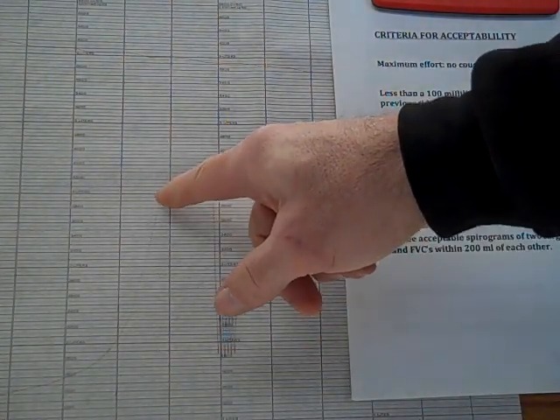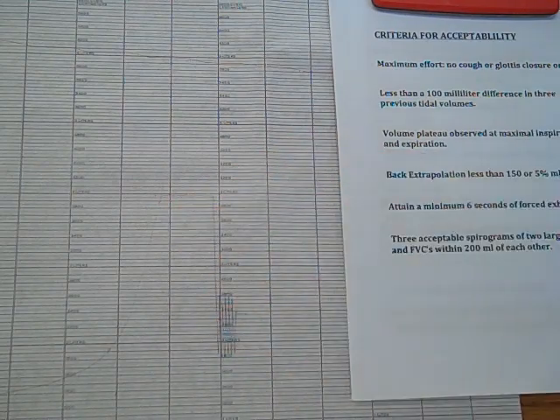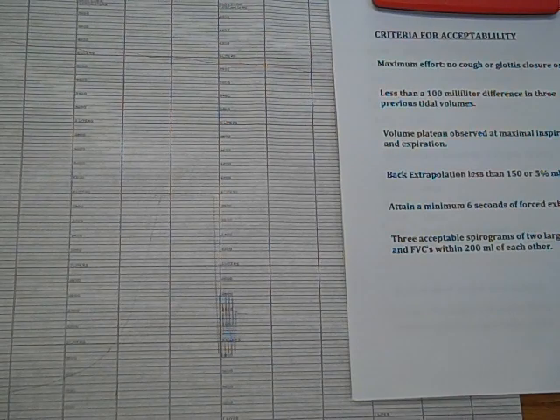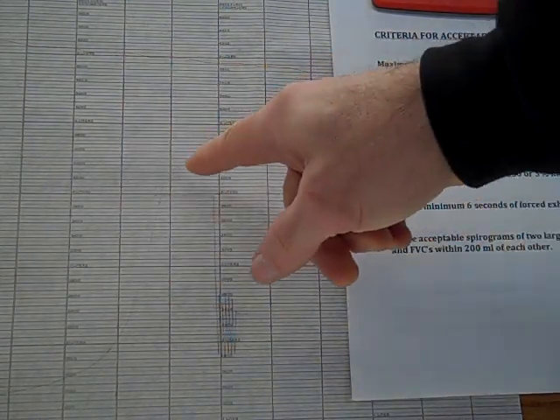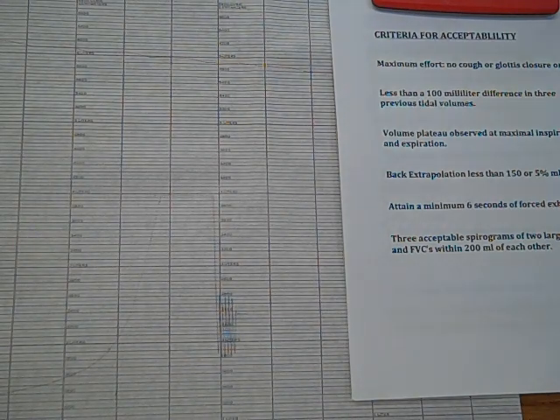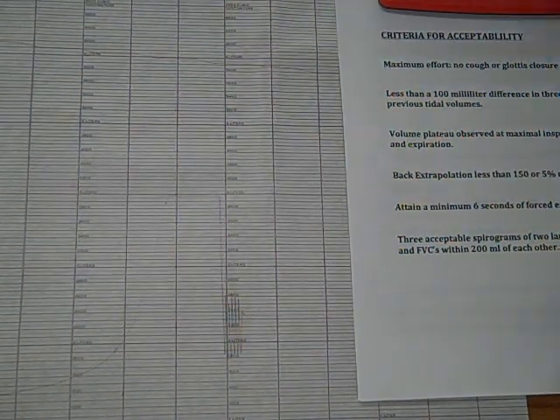And this is the takeoff point, which needs to be very crisp and sharp, so there isn't a lag there of 150 milliliters or more. We need to attain at least 6 seconds. So the exhalation needs to exceed 6 seconds, and this one is approximately 7.5 seconds. And 3 acceptable spirograms are within 200 milliliters of each other. I have only shown one here just for simplicity's sake.